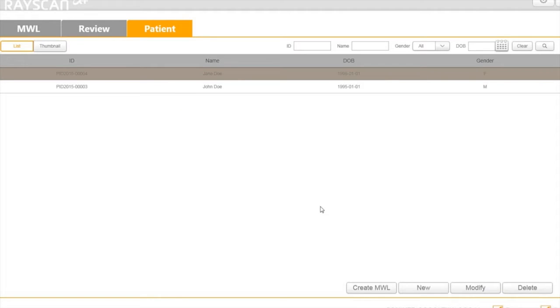If you need to modify the information, click the Modify button and change the settings.